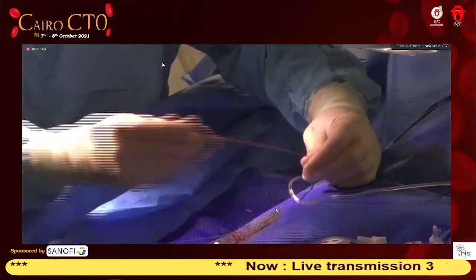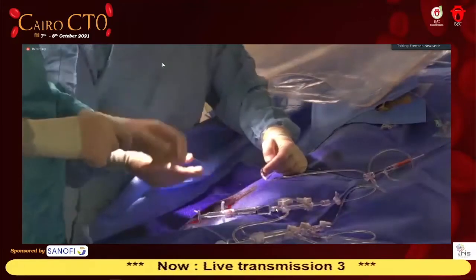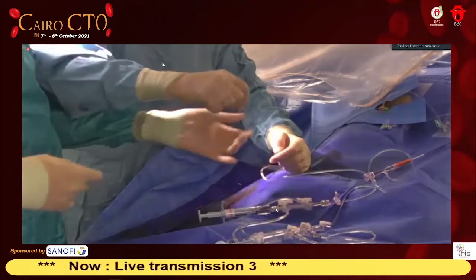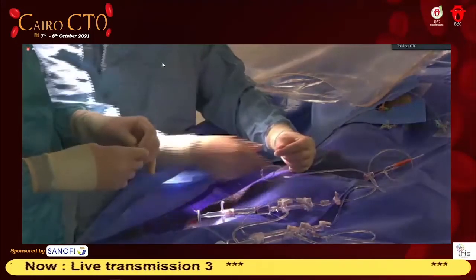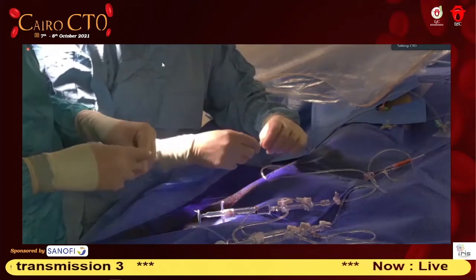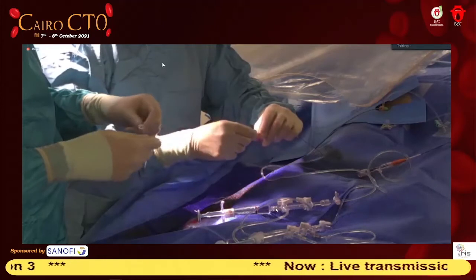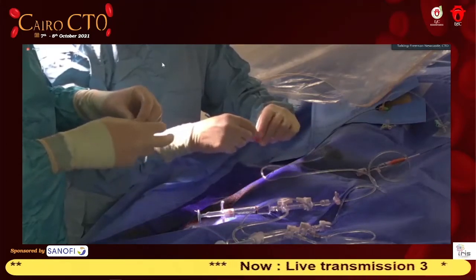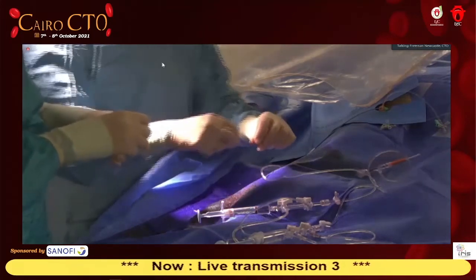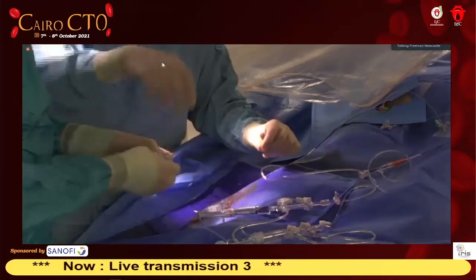Okay. As I said, if you're coiling an aneurysm, I'll take the stilet, you just take some saline and inject it. Was it an 018 wire you push? Sorry, what wire do you push now? The stilet that comes with the catheter itself. It's a very slippery stilet. This wire pushes the coil. So this stilet will push the coil inside.